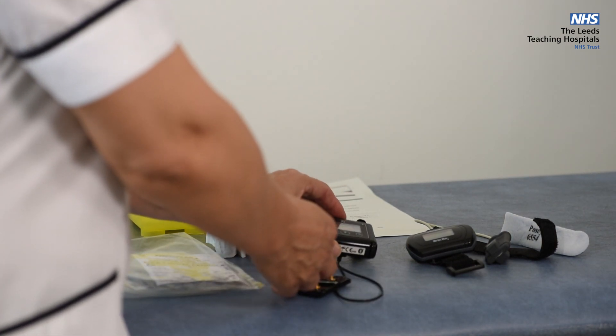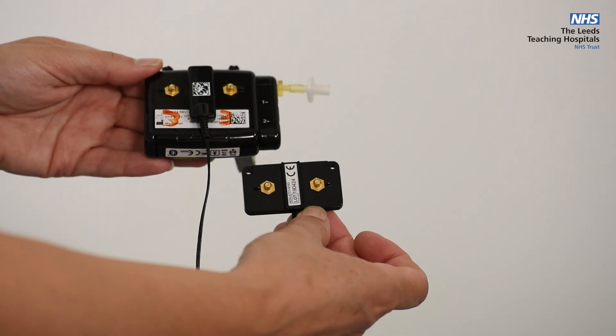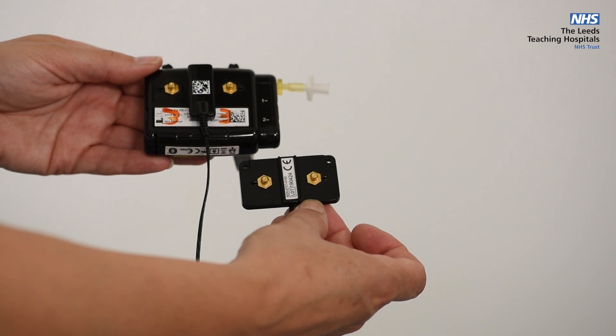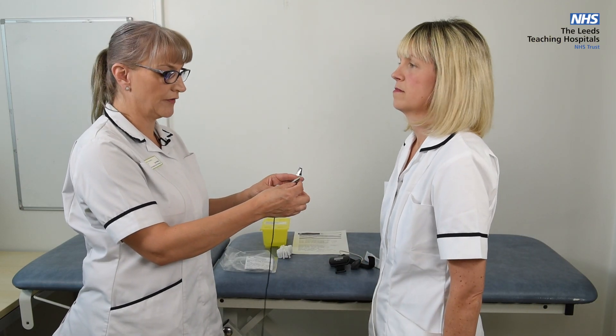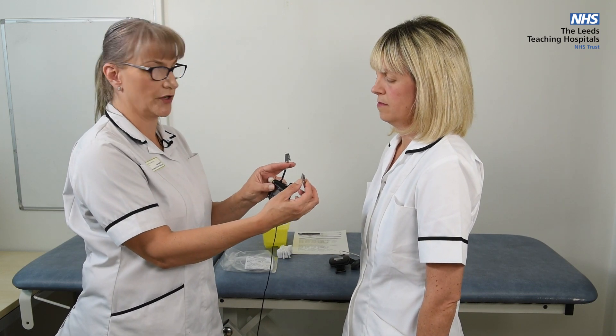This part of the equipment on the back has two press studs with an extension also with two press studs. This part of the equipment clips onto a piece of clothing — so your nightie, pyjamas or a t-shirt — using the crocodile clips.